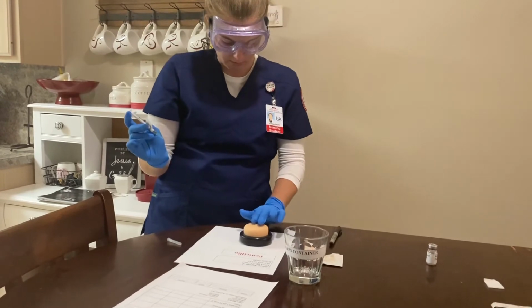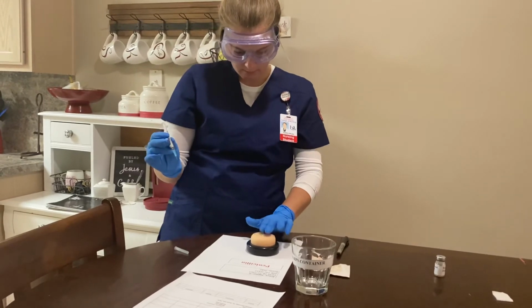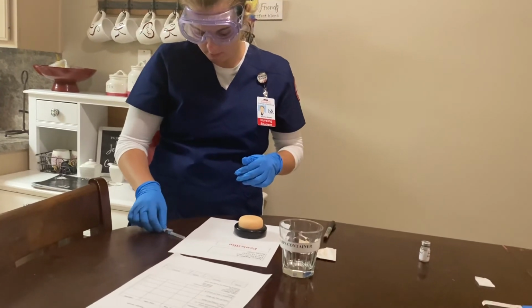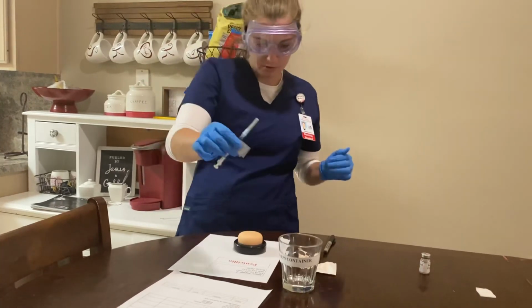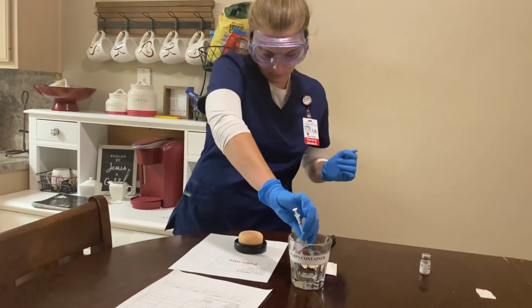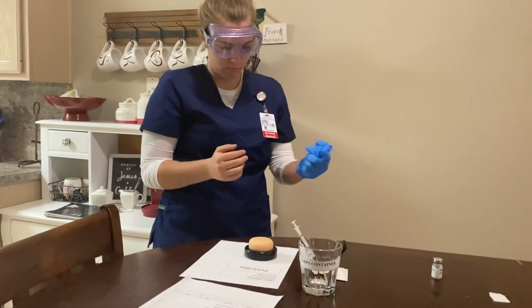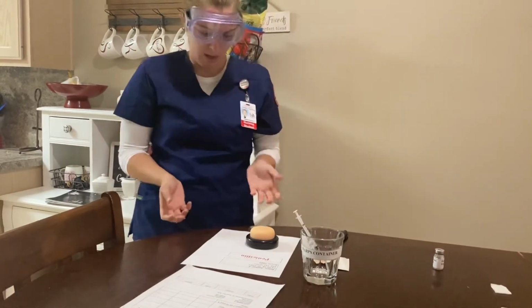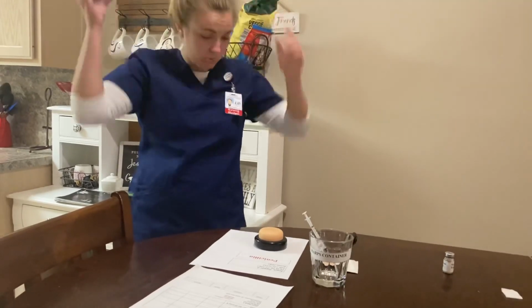And then I'm going to put light pressure on around, making sure I don't massage. And then I'm going to recap because I don't have a safety part. I then would dispose of this in these sharp containers. I have this labeled. I then would remove my gloves. And throw that in the trash can. And then I would raise the bed and then raise the side rails, and then also remove my goggles.